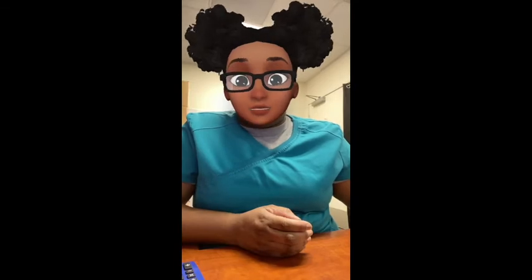The Veress needle is used in many cases to gain access to the peritoneum. The Veress needle goes into the body, and often they'll hook up the insufflation tube straight to the Veress needle, following with a trocar and then switching everything out. This is going to be one of the first things you'll have on your Mayo stand.